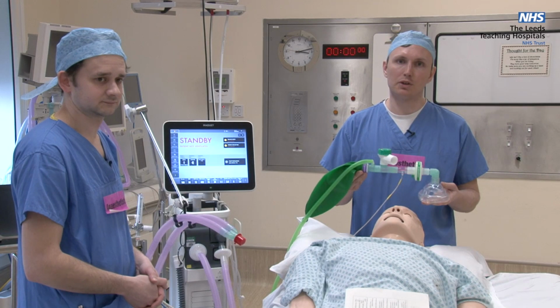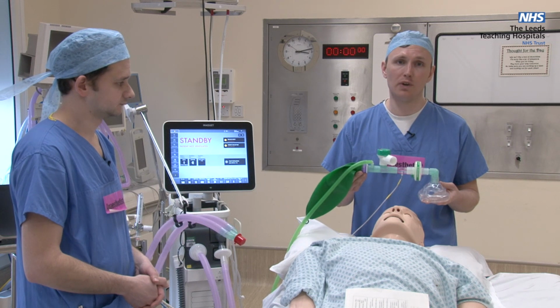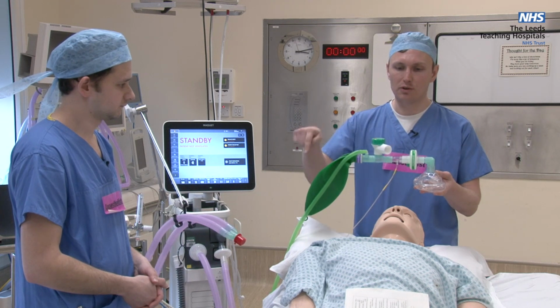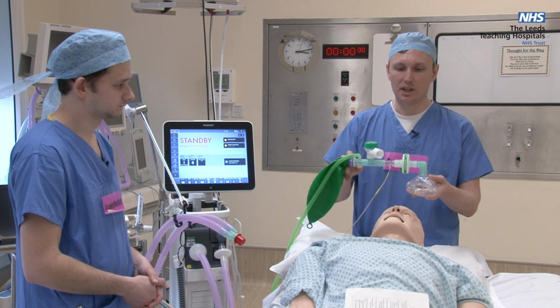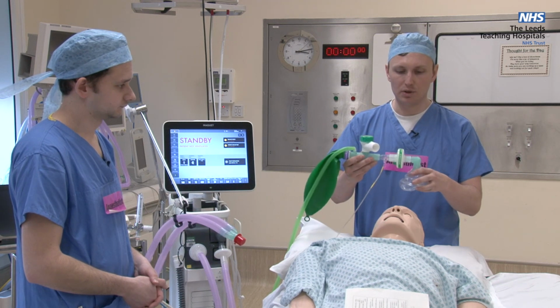So this is a brief description of how we're going to go about pre-oxygenating the patient and the specifics of pre-oxygenating a patient with COVID. So we've already assembled our Mapleson C circuit as shown. So we've got the Mapleson C circuit, the end-tidal CO2 in line, a HME filter, and then the mask. And so the aim of that is to protect the CO2 line from becoming contaminated with the virus.